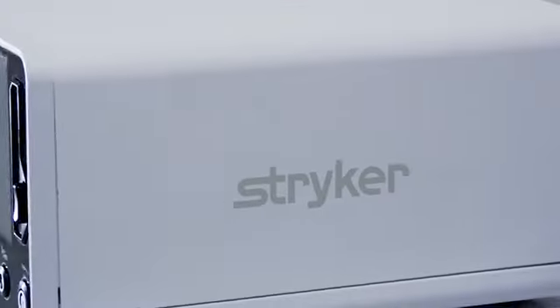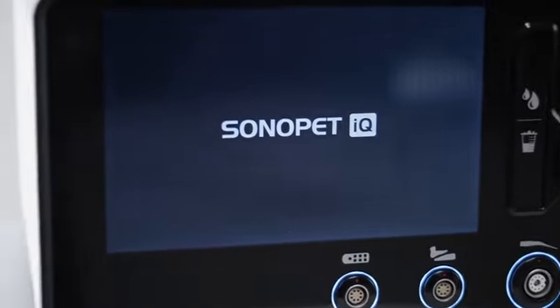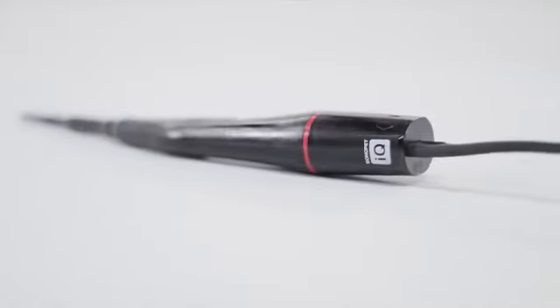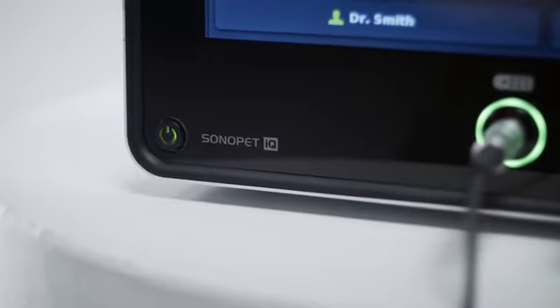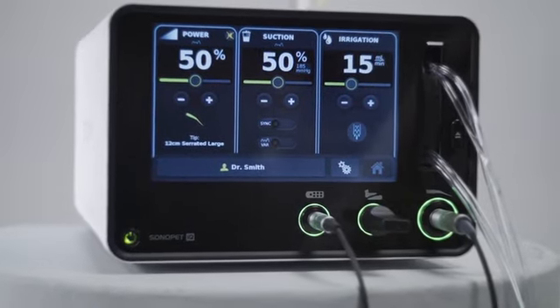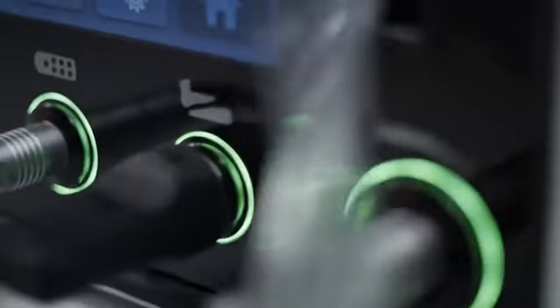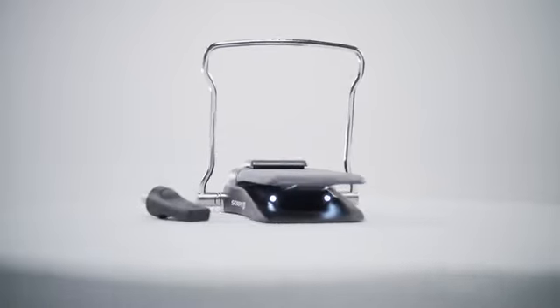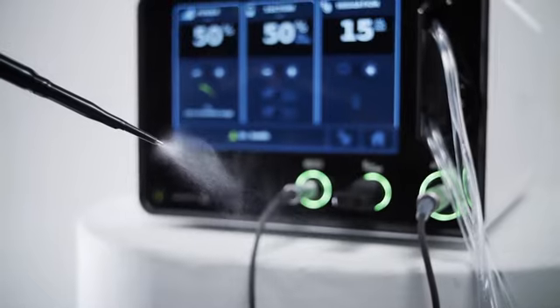Stryker's Sonopet IQ ultrasonic aspirator system is intended for use in a professional healthcare environment in surgical procedures where fragmentation, emulsification, and aspiration of soft and hard tissue is desirable. Please refer to the IFU received with the Sonopet IQ for a full system setup using all available components.